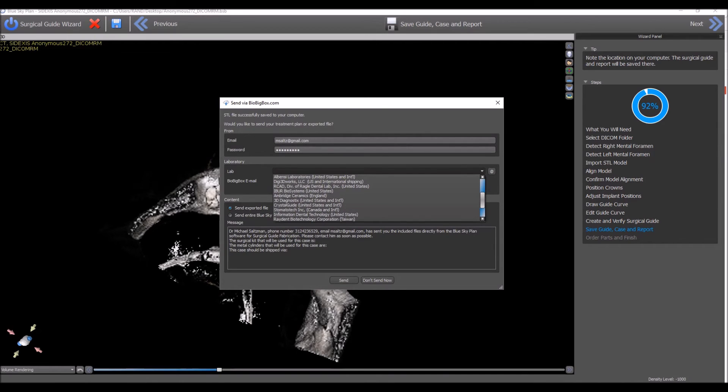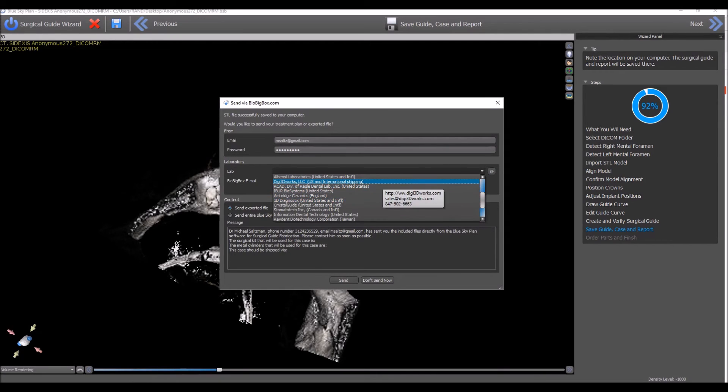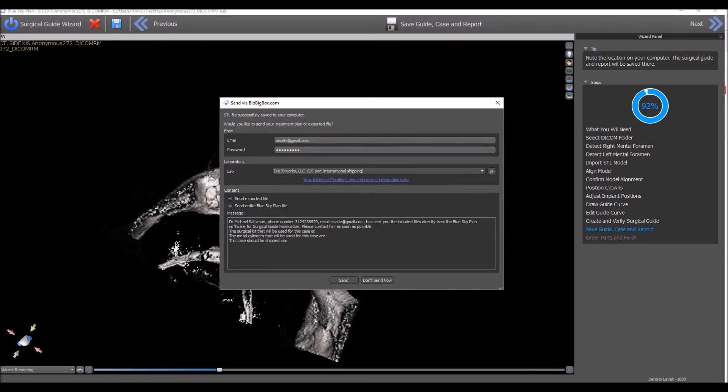So if you're sending to one of these laboratories, you don't even need to know their email address. You can select the relevant laboratory and send it, and the email address is built into the system and the lab will receive it.